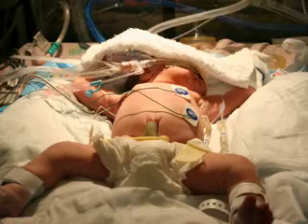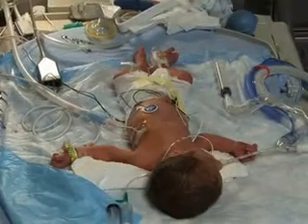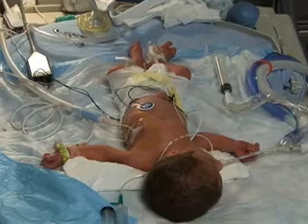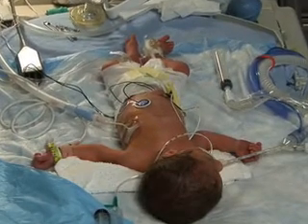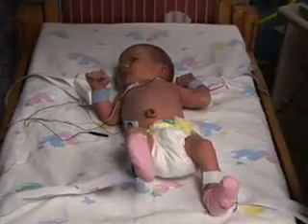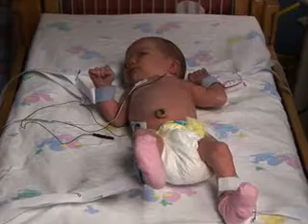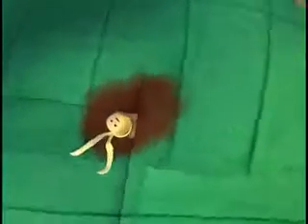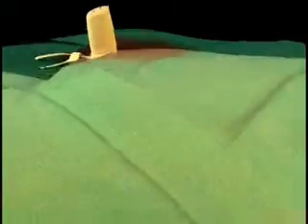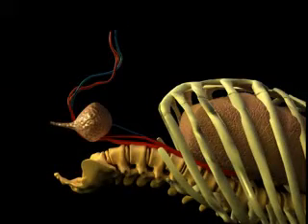The length of time an uncomplicated catheter may remain in place is the subject of some controversy. At present, we recommend strict adherence to individual institutional policies until consensus on this important issue can be obtained. The placement of umbilical catheters is an indispensable technique used to stabilize the condition of critically ill newborns. Proper insertion technique and knowledge of potential complications will improve the utility of these catheters in the newborn population.